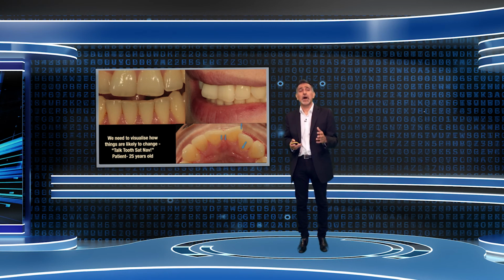And all that's going to do over time is cause more wear and chipping on those teeth than it should. I mean, it's very, very predictable it's going to happen. Therefore, if we actually treat a case like this, I'm treating it because of that particular area. And I know over time that the patient's mesial point of those centrals will become more worn, and you'll see a steeper V shape occur. Someone will try and do bonding on it. Someone may even end up trying to do a veneer or something on it.